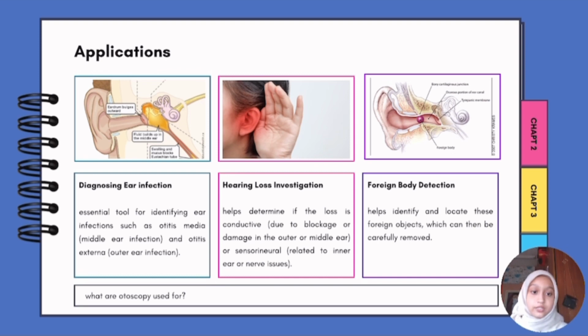Otoscopy is a crucial diagnostic procedure in medical practice, offering a direct and non-invasive method to examine the ear canal and eardrums for various conditions. Here are three examples of otoscopy applications. The first one is diagnosing ear infections.